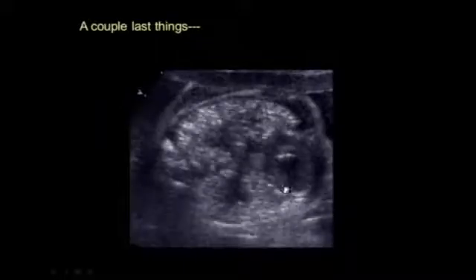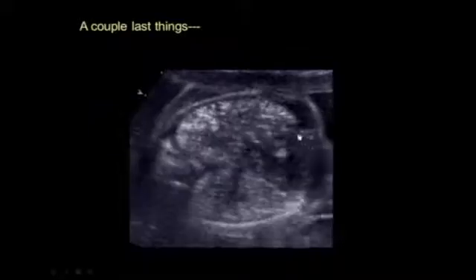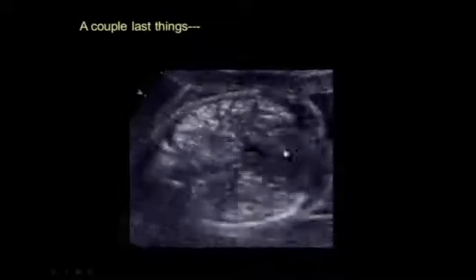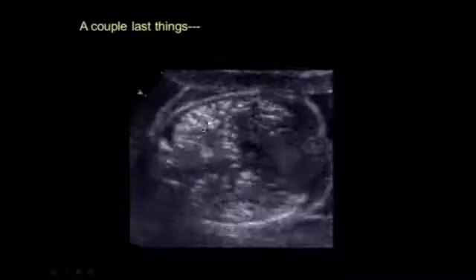This is a fetus who had undergone an interventional procedure to open a stenotic aortic valve, where the needle is placed from outside through the mom, through the placenta, through the amniotic fluid, through the chest wall, into the left ventricle, a wire placed through the aortic valve, a balloon placed over the wire, and the aortic valve opened. At the time of the placement of these catheters, air was released into the ventricles and out to the lungs, and these are little tiny pockets of air throughout both lungs following that interventional procedure. And that resolved within 15 minutes.